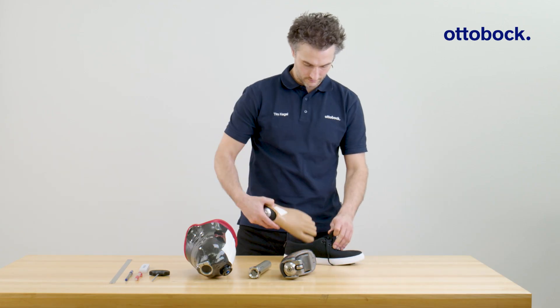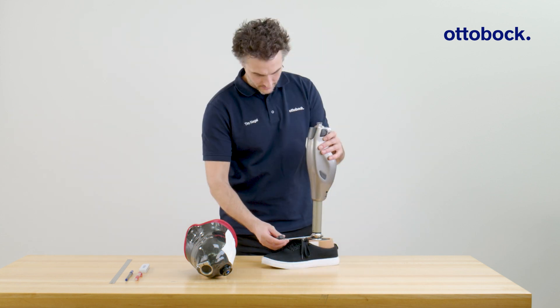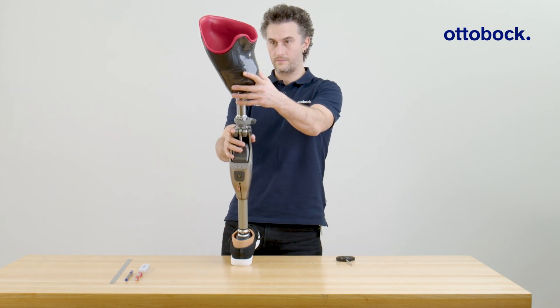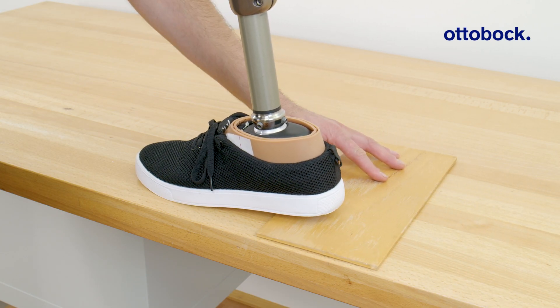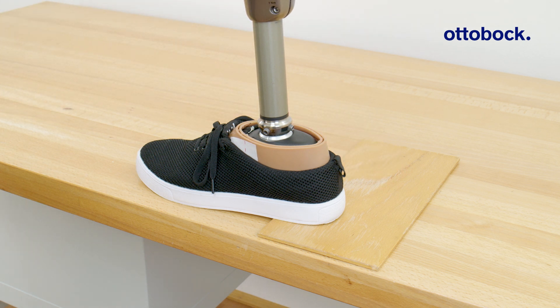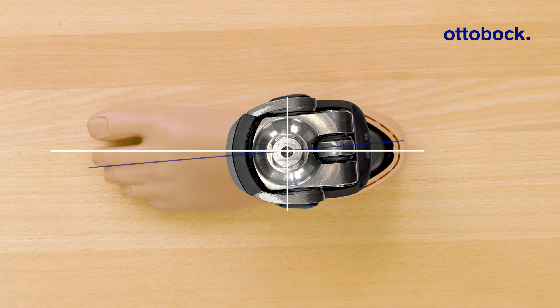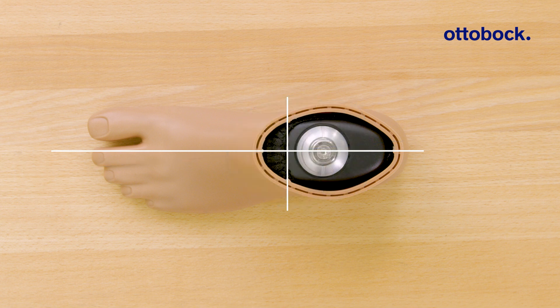Now it is time to assemble the components. Keep in mind to align the prosthesis with the user's shoe. Also put a five millimeter thick wedge under the heel — this provides additional safety when first standing on the prosthesis. Align the knee joint with an external rotation of approximately five degrees so that the laser line runs between the big toe and the second toe.